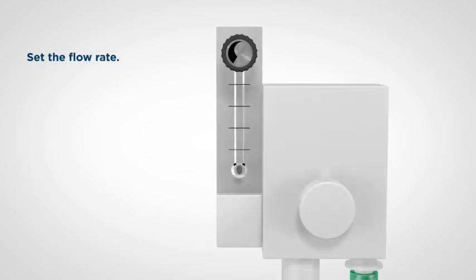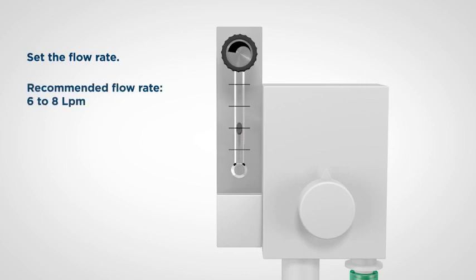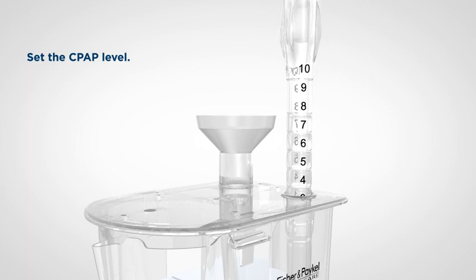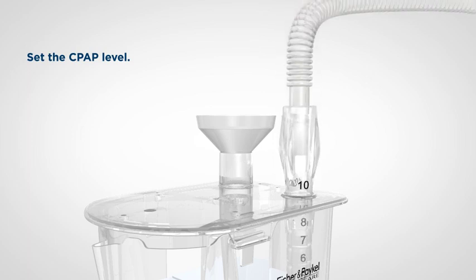Turn on the flow from the oxygen blender and adjust the flow rate to the prescribed input flow rate. Recommended flow rate is 6 to 8 litres per minute; allowable flow range is 4 to 15 litres per minute. The number on the CPAP probe above the lid indicates the CPAP pressure in centimetres of water — for example, a setting of 6 centimetres of water. Set the CPAP probe at the prescribed level: 3 to 10 centimetres of water.